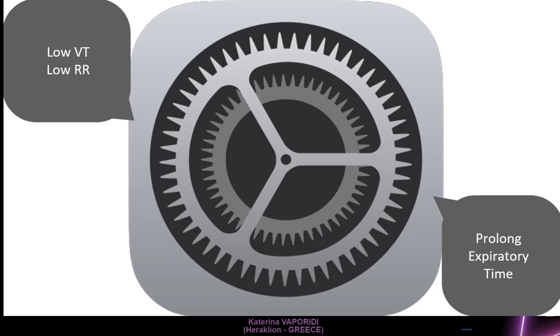For invasively ventilated patients, the initial ventilator settings in a control mode aim to manage dynamic hyperinflation, so both tidal volume and respiratory rate should be kept as low as possible, aiming to manage severe respiratory acidosis but not normalize PCO2, and provide adequate expiratory time to facilitate lung emptying.